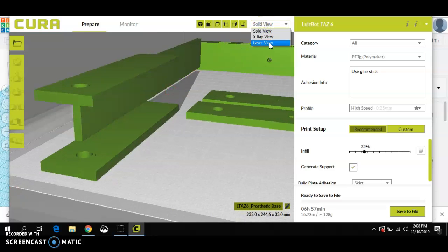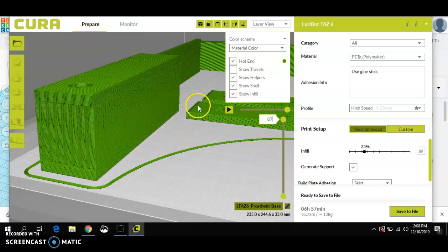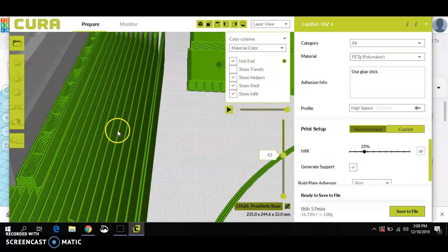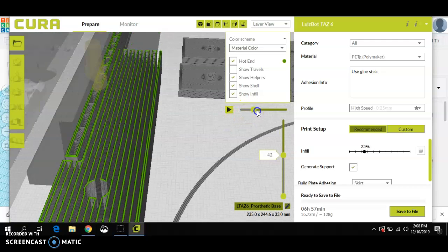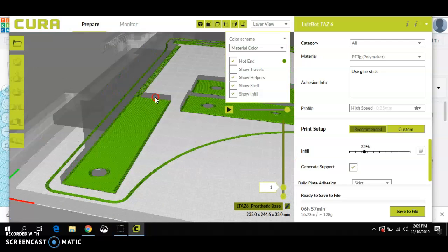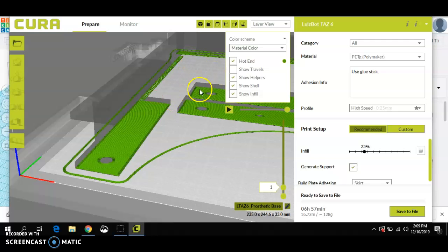I always like to check my model in layer view. In layer view, you see what shows up here is the infill. Right here, this is infill that you would have to break out later if you printed this way. Now, also in layer view, you can actually see exactly how the print head is going to print, just for fun mostly. Okay, you can see how each layer will print. But it's really critical to check the base layers, and make sure that they are flat on the print bed.